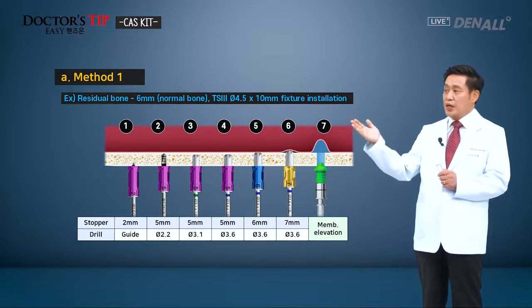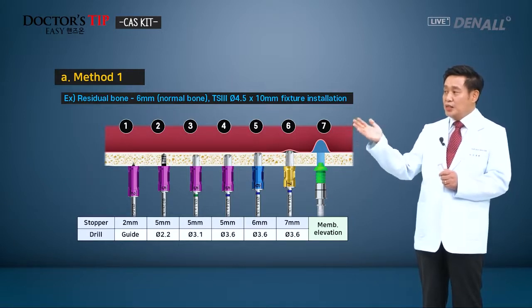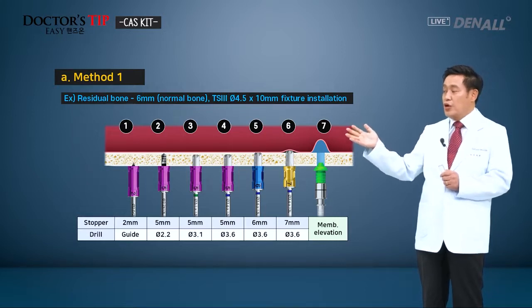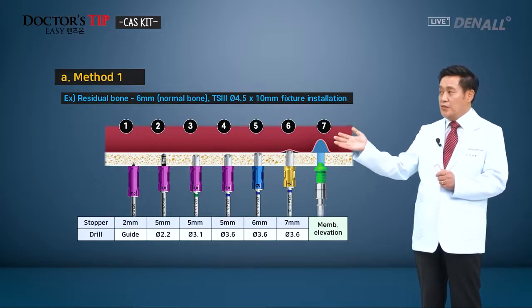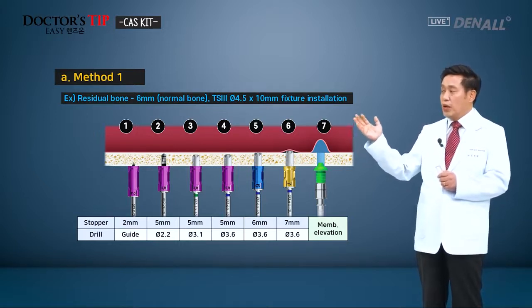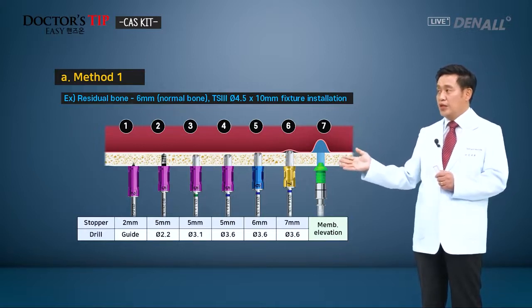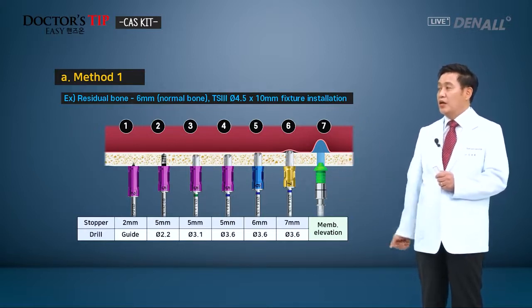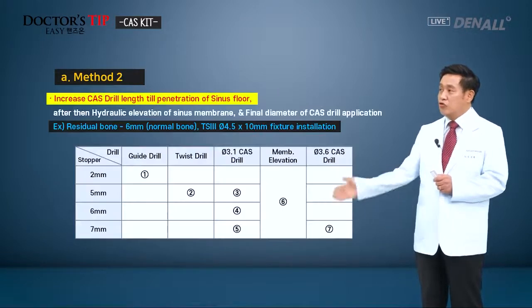Using a twist drill, we go up to 5 millimeters. CAS drill is used 3.1 and 3.6, using the same 5 millimeter stoppers. Then 3.6 is used to advance into 6 and 7 millimeters. The sinus floor can be penetrated without damaging the membrane using the hydraulic elevation.